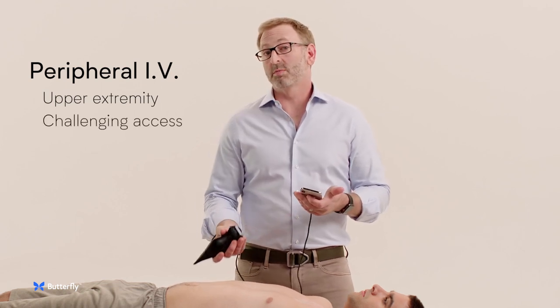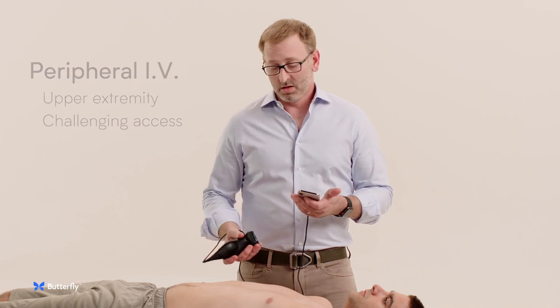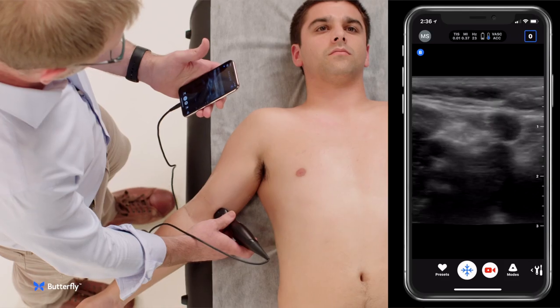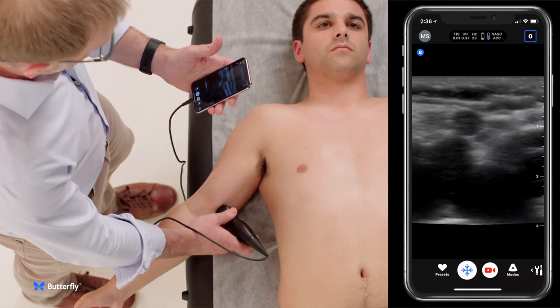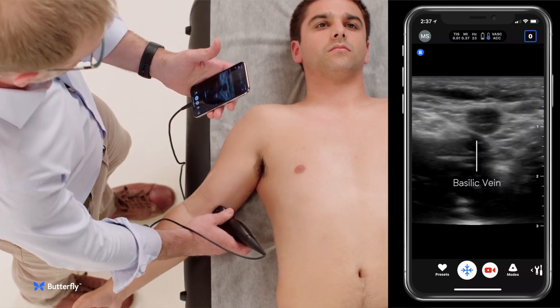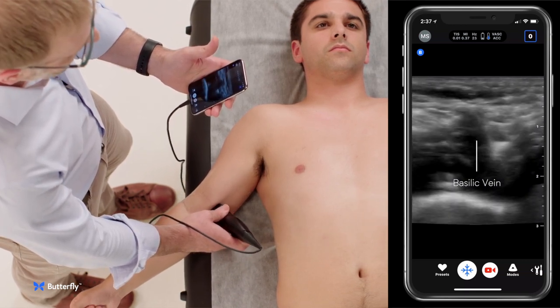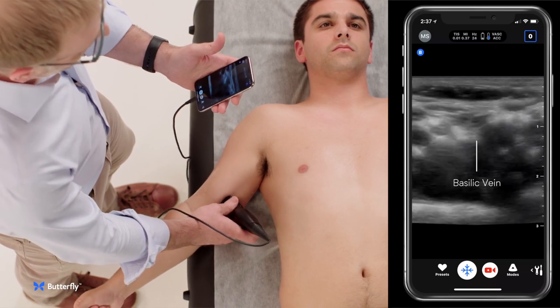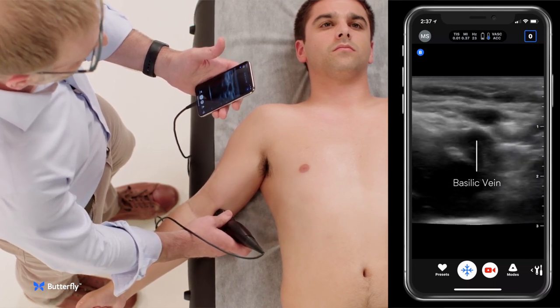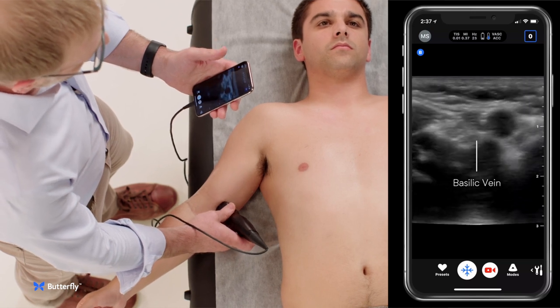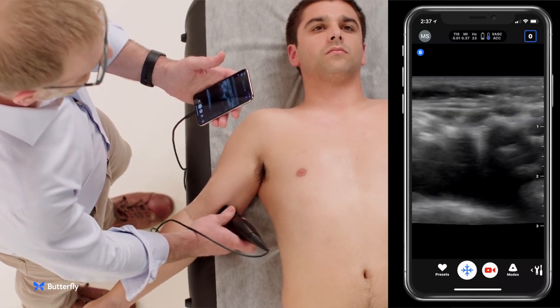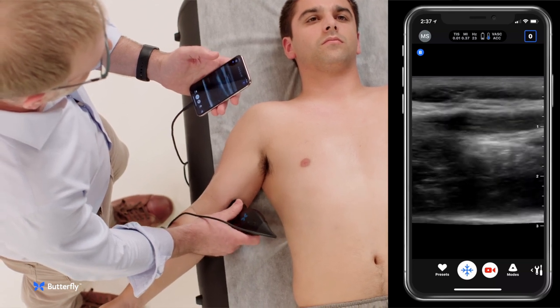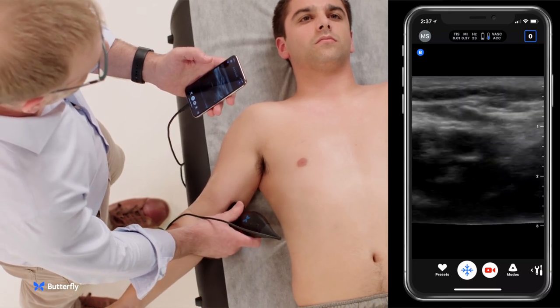First, we'll look at the basilic vein. We're going to look at the medial upper arm just above the elbow, and the basilic vein is right in the center of the screen here — anechoic, compressible. There's no adjacent artery for the basilic vein, which makes it a very attractive target for IV placement. You can identify it and cannulate it in a short axis like this, or you could turn and cannulate it in a long axis.